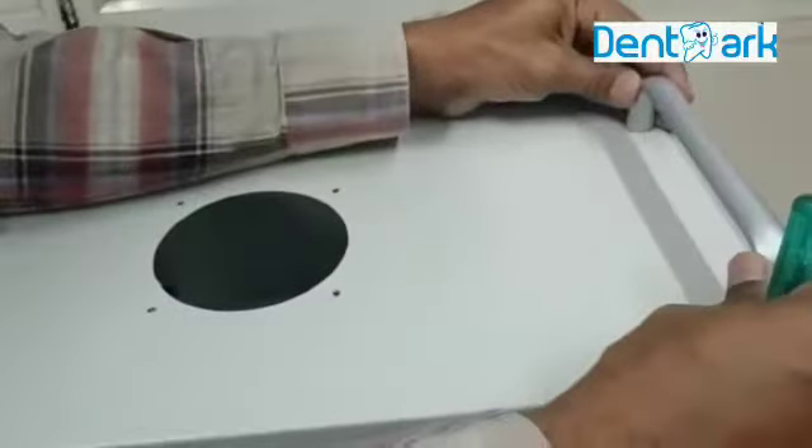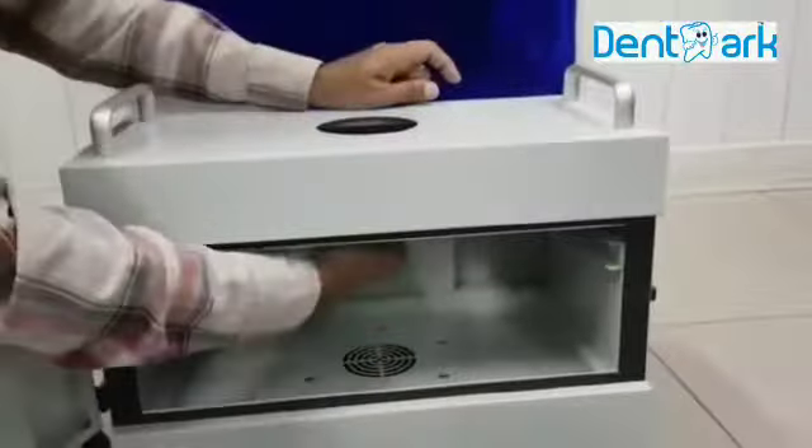These are the handles. From the down side you can put the screw here, on both the sides, and similarly on this side also. You can tighten from here. And this is the UV tube also, so please take care while you fix the handles.